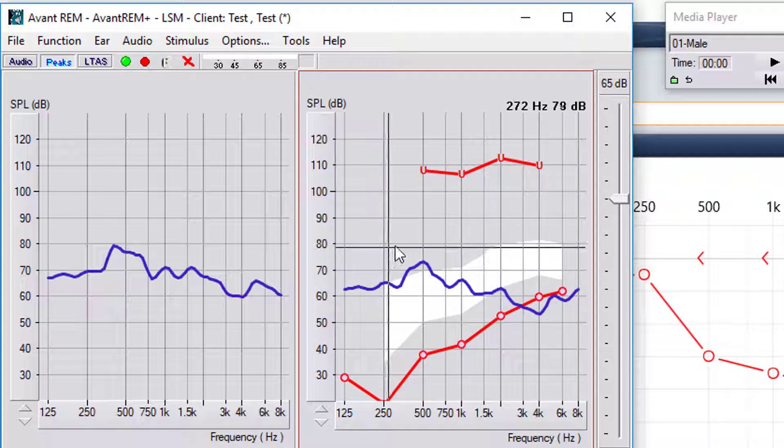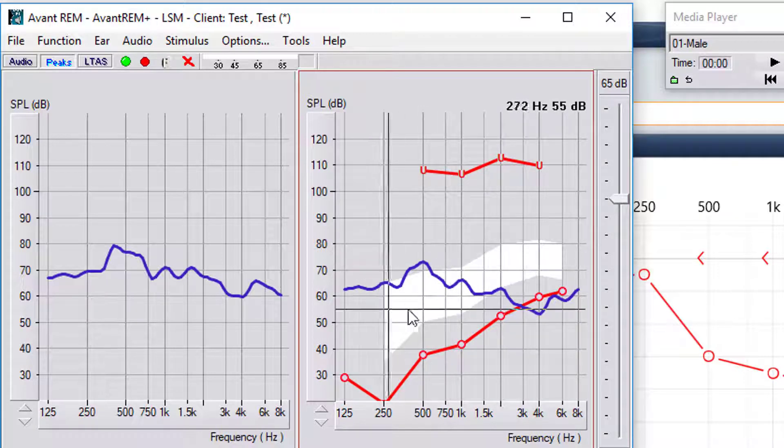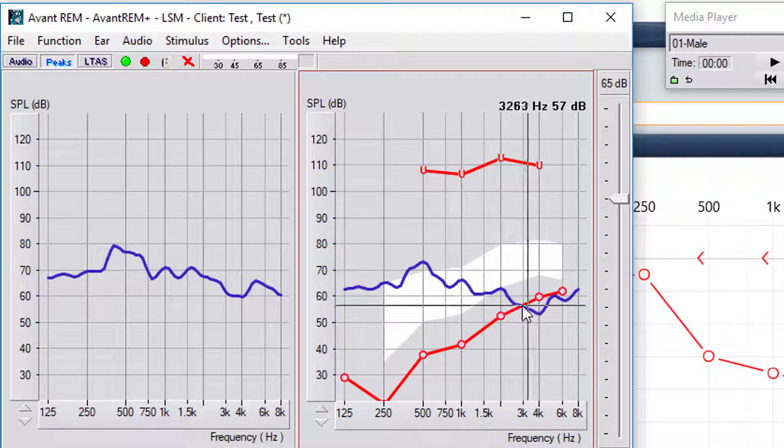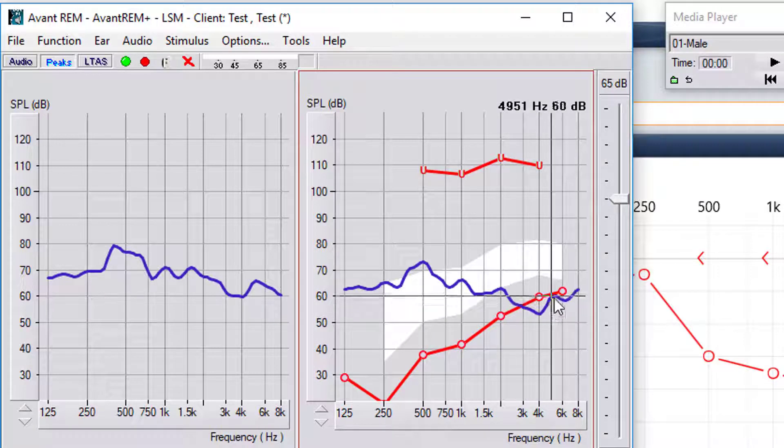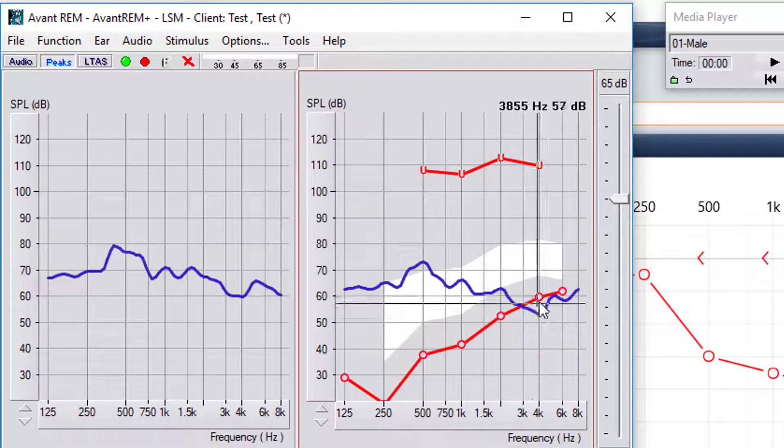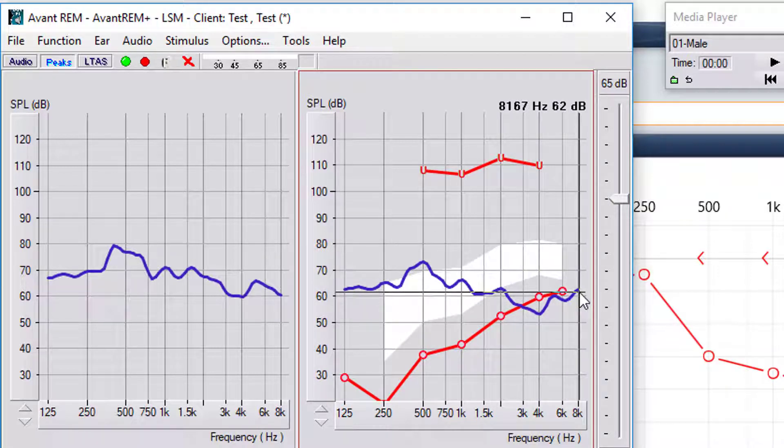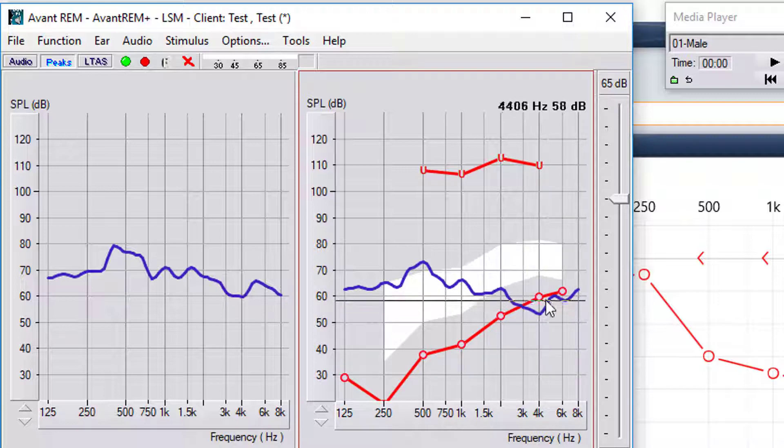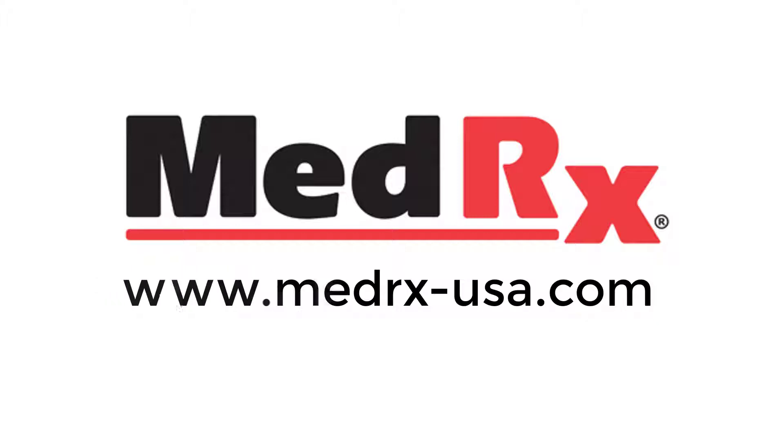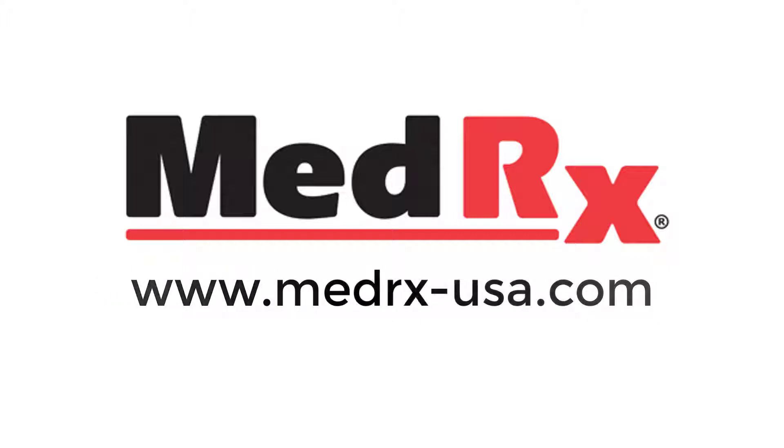Now looking at this, anything that's below threshold is considered unaudible. So at 3000 out in this particular audiogram, this is not audible to this patient.